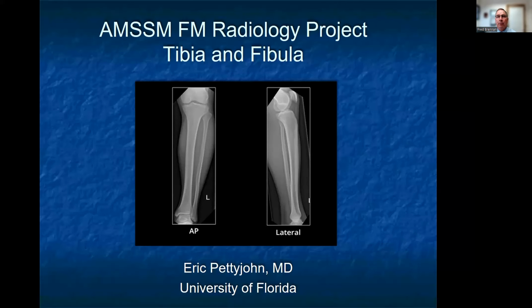Good morning. This is Fred H. Brennan, Jr., DO. I'm from the University of South Florida, the Morton Plant Bay Care Family Residency, as well as Sports Medicine Fellowship. I am presenting this lecture today on the MSK radiology project for family medicine residents. And this is a presentation on reviewing tib-fib x-rays, tibia and fibula x-rays.